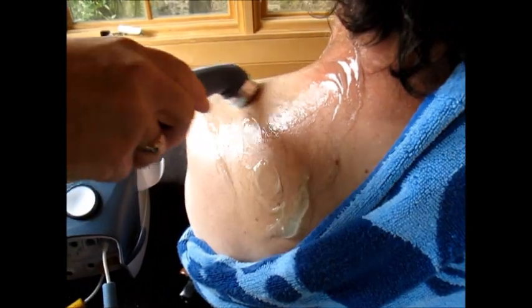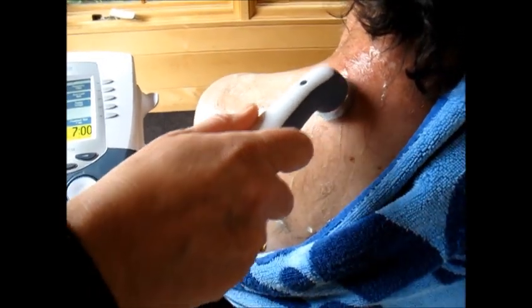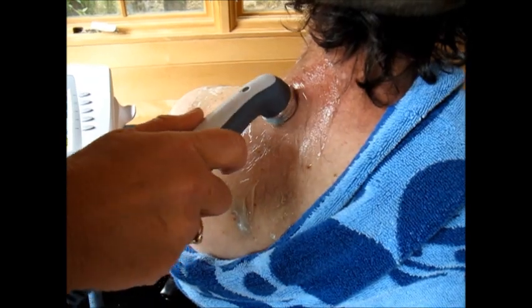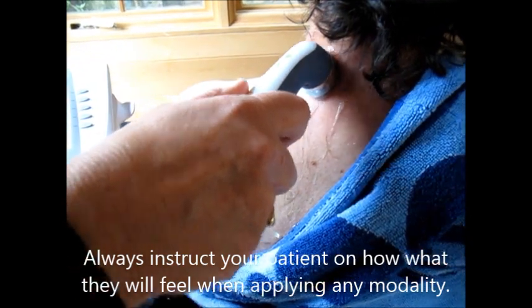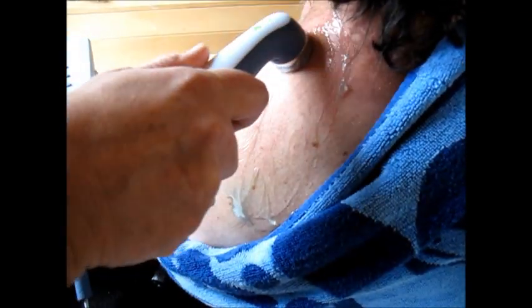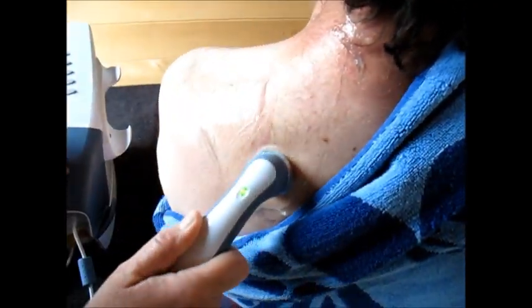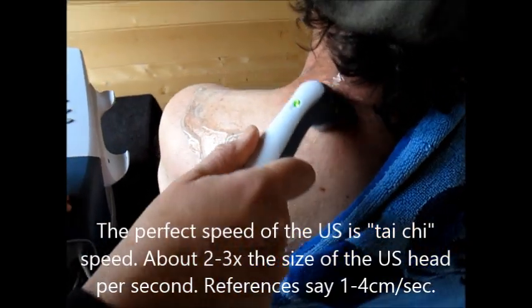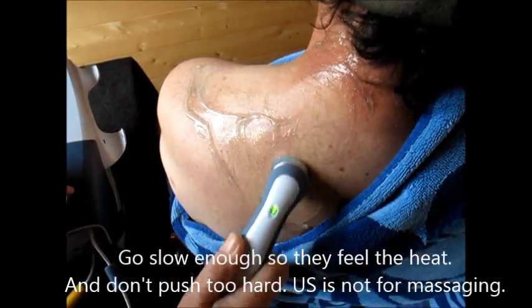Now I'm going to turn this on so you can see me working with the patient. I've spread the ultrasound gel and I'm starting the ultrasound now. You'll be feeling a warmth — raise your hand if it gets too hot. Once the light is on, you need to start moving the head. Some older machines don't have an indicator light, so you have to watch the dial to see if the intensity is going up. It's about 1 watt per centimeter squared. If you go too quickly, the patient won't feel the heat and you'll have wasted everybody's time.